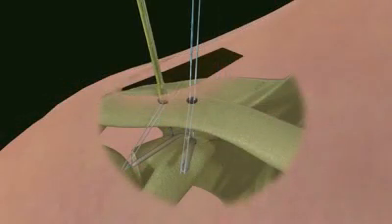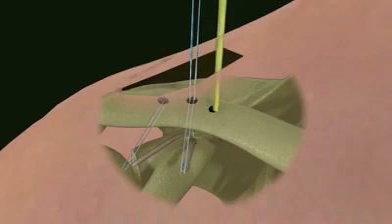Drill two 4.5 mm holes in the clavicle. Size the holes for the ends of the graft.